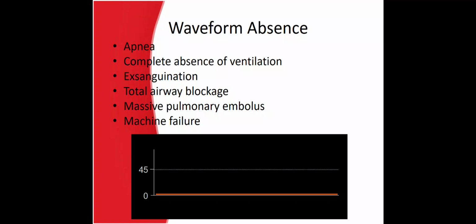The absence of a waveform can indicate a number of things. These may include apnea, a complete absence of ventilation, exsanguination, total airway blockage, a massive pulmonary embolus, or machine failure.